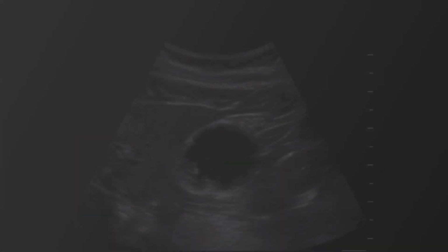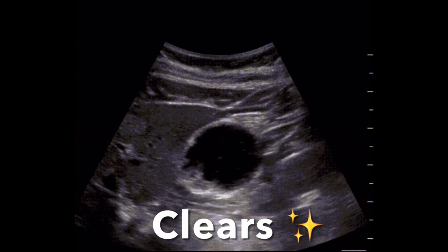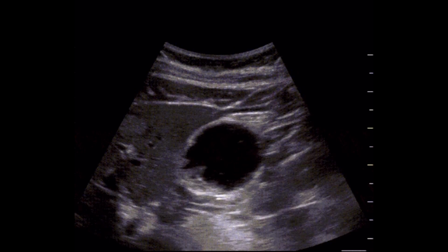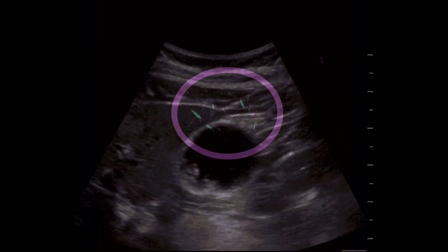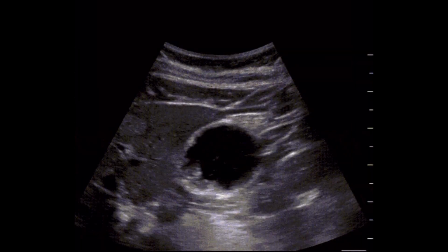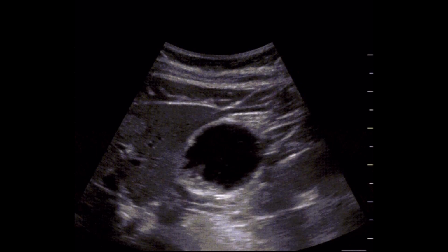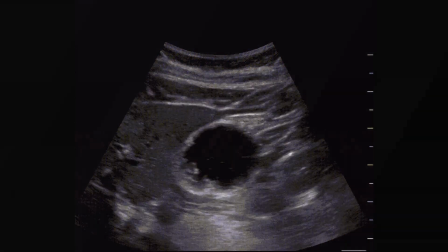Okay, clears. How do we describe clears? Starry night. Yep, starry night. You just see black, and sometimes you see bubbles. It's not flattened like the other image, so we call this the starry night appearance. I made this little animation. You can see the starry night. Going back, this is what the image looks like: round, kind of big, just a black ultrasound image.